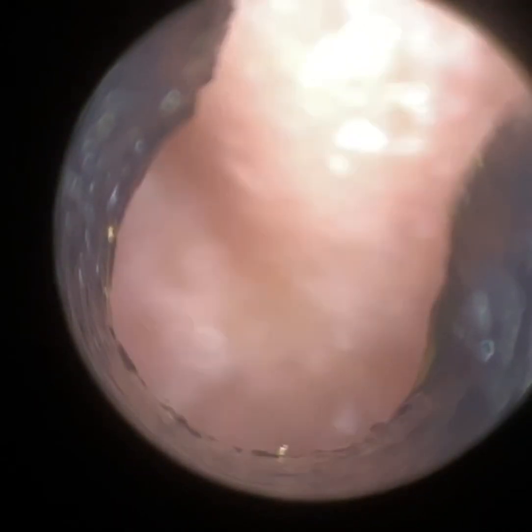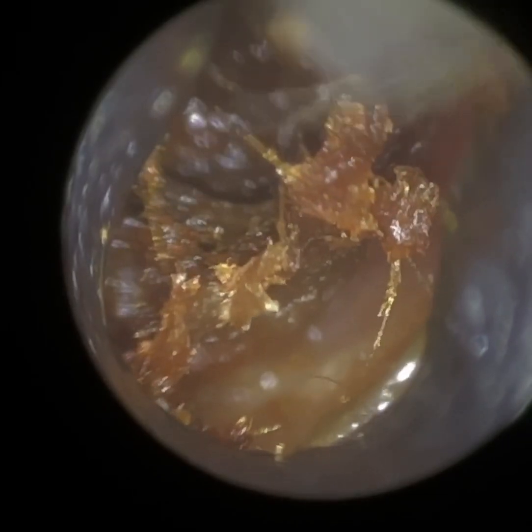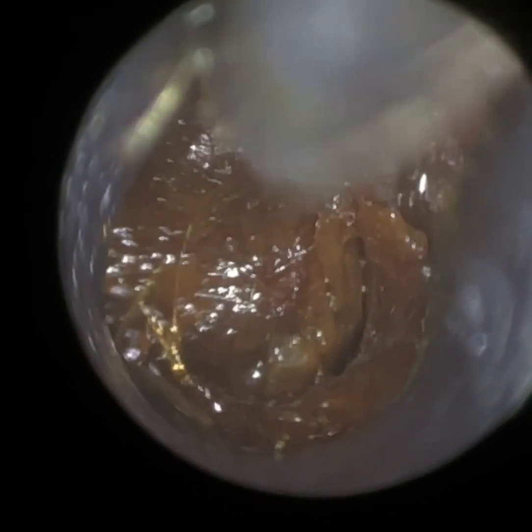We are getting this wax out of the ear. I didn't get time to take a photo at the end of the procedure — there was a hell of a lot of wax and the patient themselves were very surprised. I explained that because the wax is quite soft and because they've been using the sleep plugs, it just compressed it. The average ear canal is approximately 3cm from the entrance to the eardrum, and when you saw this wax it was far more than 3cm worth but had all been compressed. So they have been suffering for a while. I've put some more drops in there as the inside of the suction probe did block.